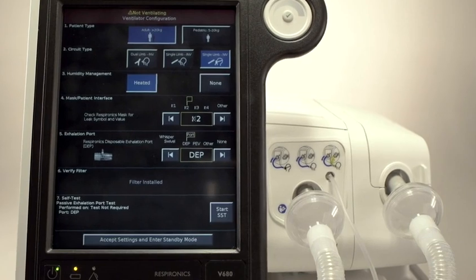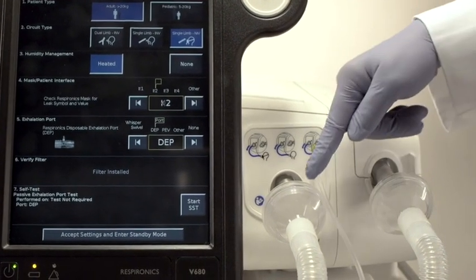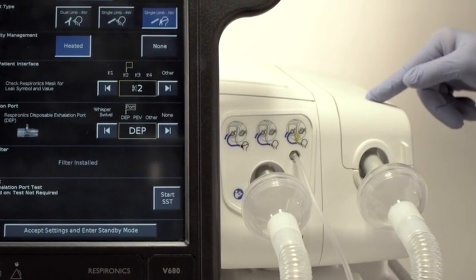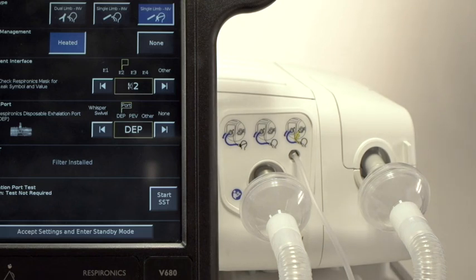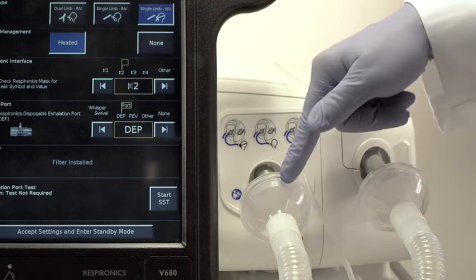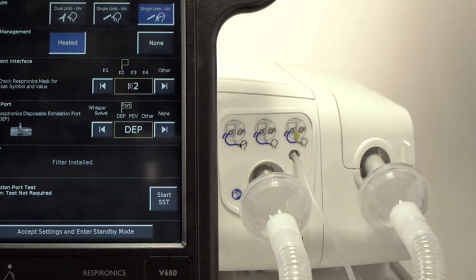First, attach the dual-limb circuit and ensure the ESIS cartridge is installed, seated, and covered. Ensure you have filters on the inspiratory outlet port and the ESIS port. This helps to reduce possible contamination to the ESIS cartridge.